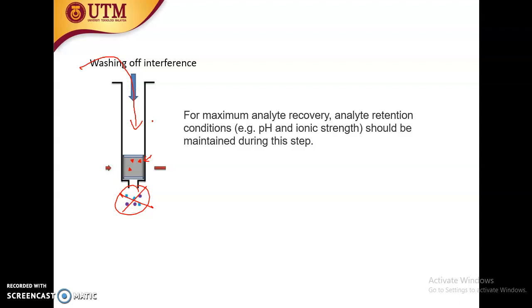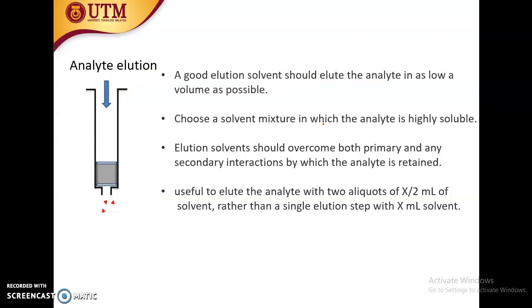Okay, remember, if let's say you want to use elution with methanol, therefore during washing you have to use either water, it's all depending on your analyte. Okay, either water or any salt solution. Okay, during elution you have to choose a good elution solvent. So what you can do is that you have to understand your analyte first.